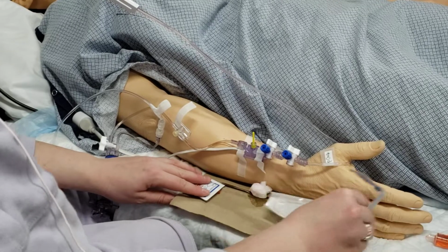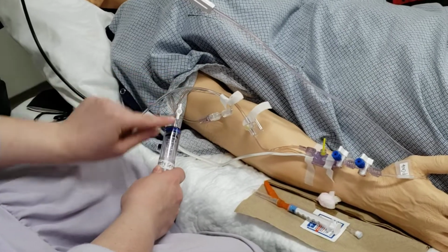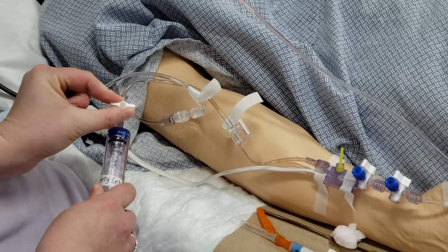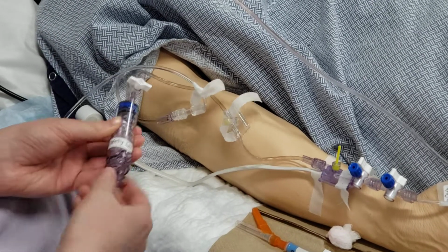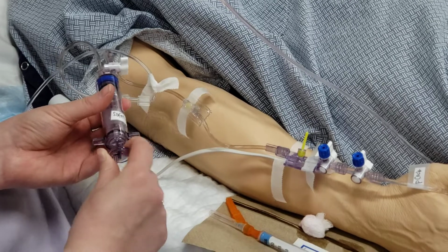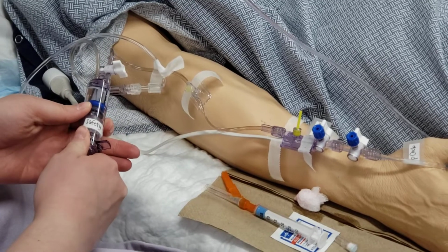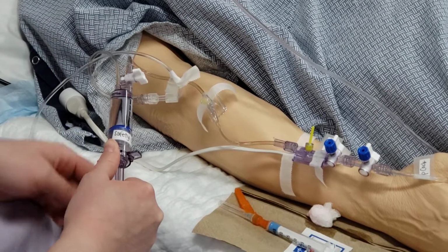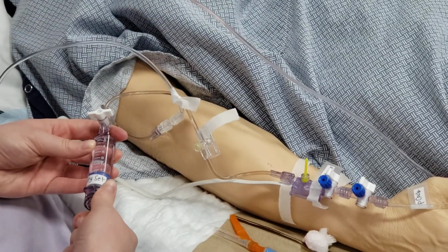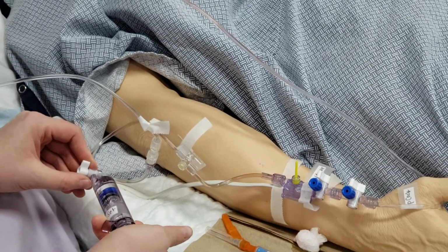Let's move all this. What you do is the stopcock looks a little different on the safety set here. You turn to open it. Down here on the bottom of the safety set, you click it, you draw back, and you can see it draws back fluid and draws back patient blood. It should be drawing back blood, sorry.